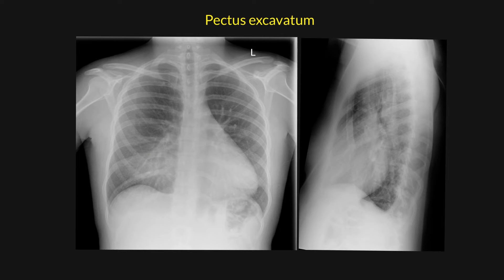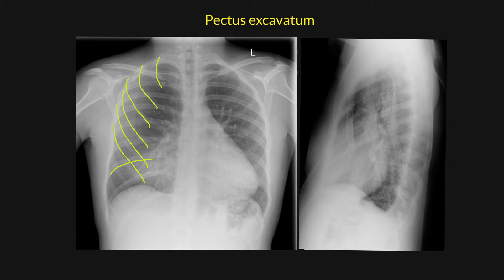One thing you should also note is that the anterior ribs tend to be more obliquely orientated than in normal chest radiographs, and as a consequence of this, the posterior ribs tend to be a little bit more horizontal.